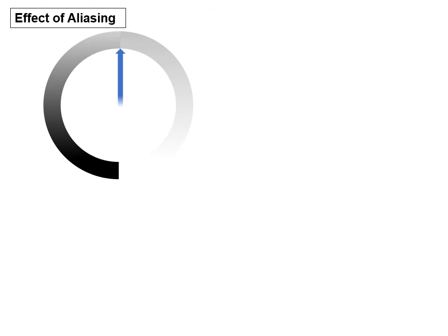Well, what happens when we exceed the limits of the grayscale? Let's take a look at this slide here. It keeps going around. This effect is called aliasing. So at some point of maximum whiteness, the material would jump and be shown as suddenly black. This is called aliasing, and the opposite effect occurs in the other direction.